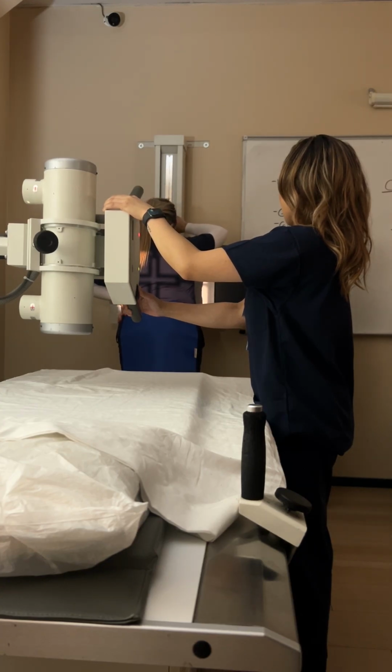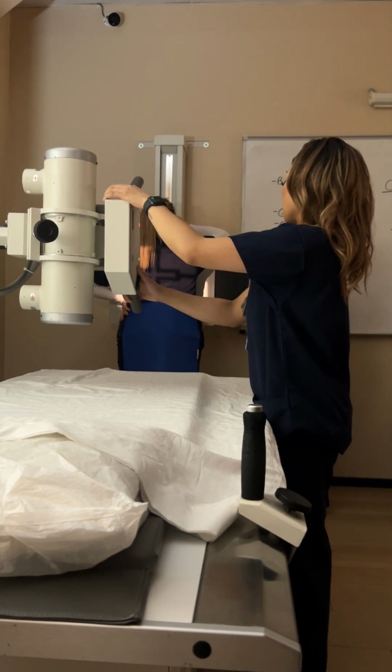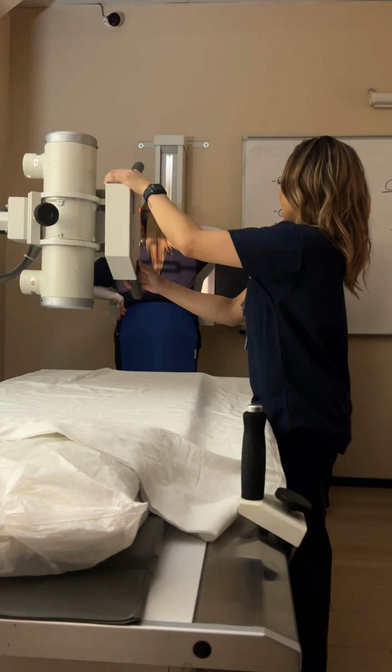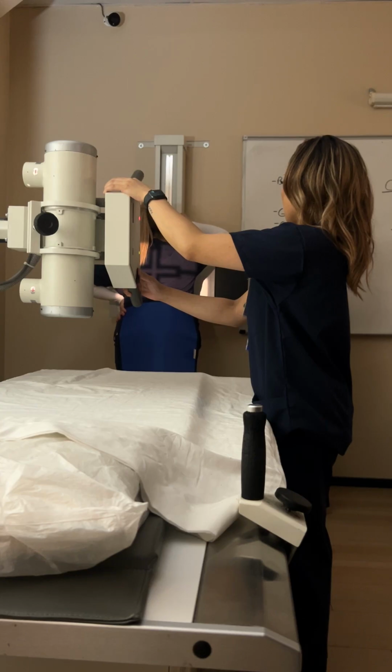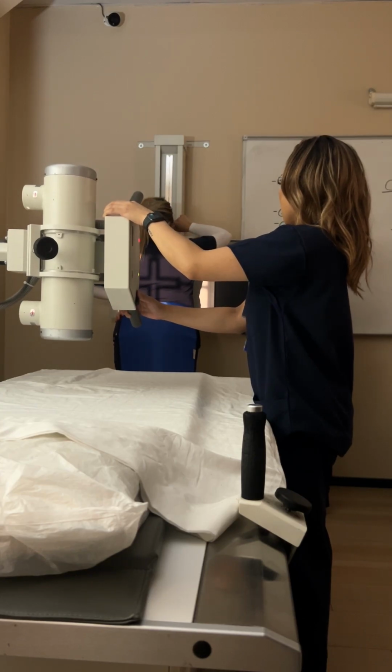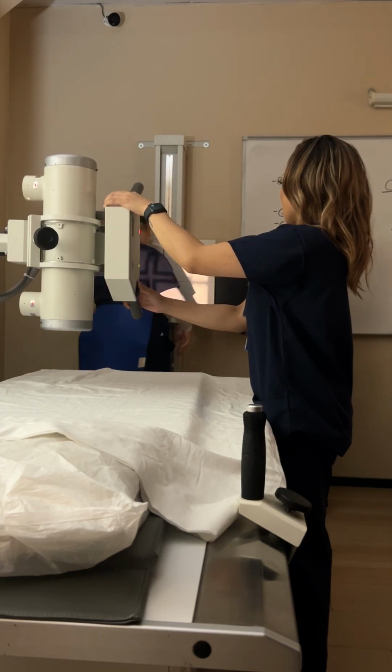So go to however high you want to go, and I'm following you with my board. You're up here at this point. It's too high. Great. Be sure it's in the light field. Bring your arms down. And then go against the board.